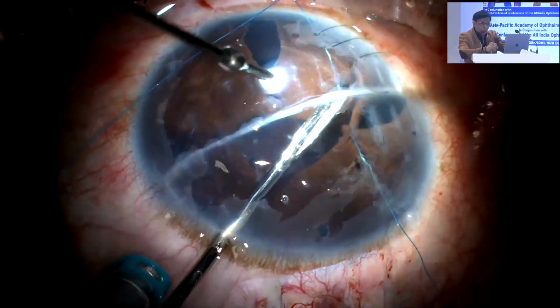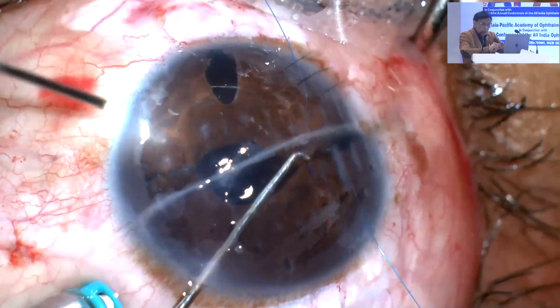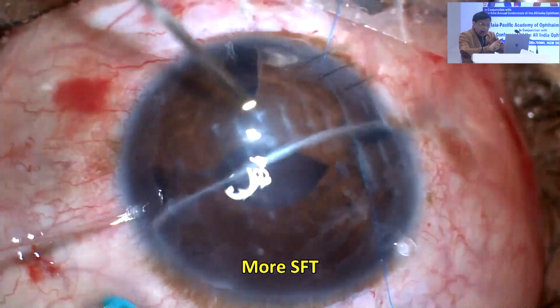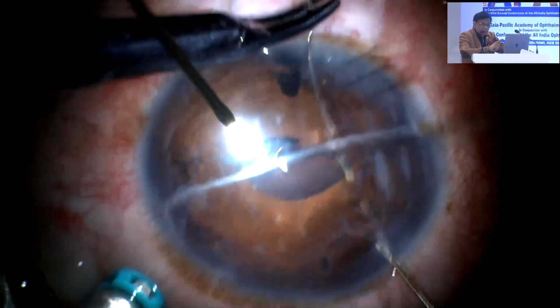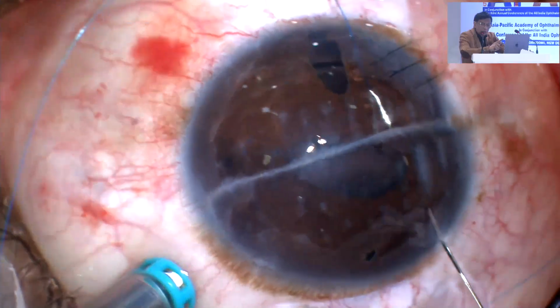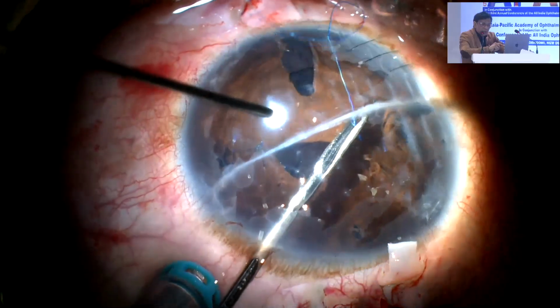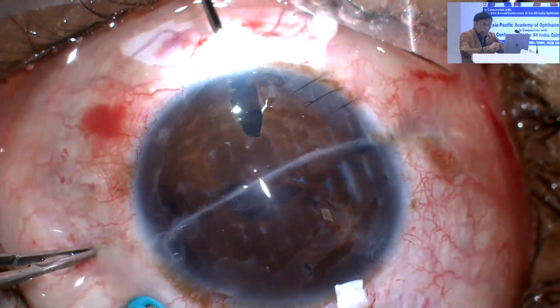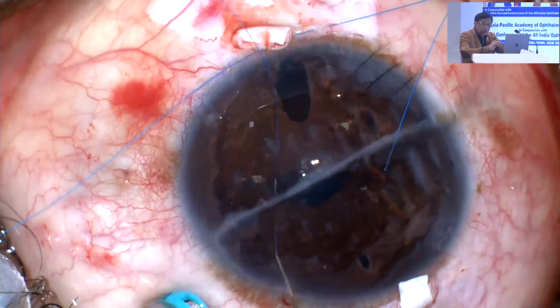As I'm doing slowly, you'll notice this pupil is becoming smaller and smaller. That small peripheral iridectomy is increasing, and if needed, I can even close that. Look at the endoilluminator trick which I'm going to show you from outside, which helps me see better. As you can see, the pupil becoming smaller and smaller. Now, remember the step here is you need to have a vitrectomy probe.